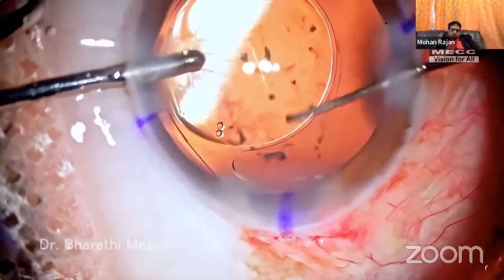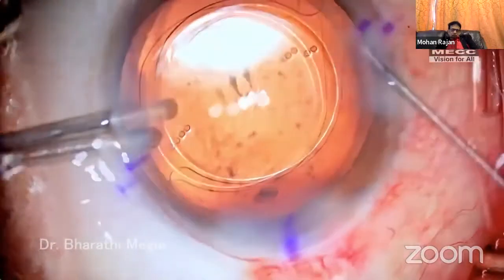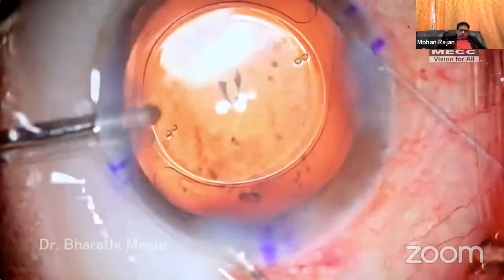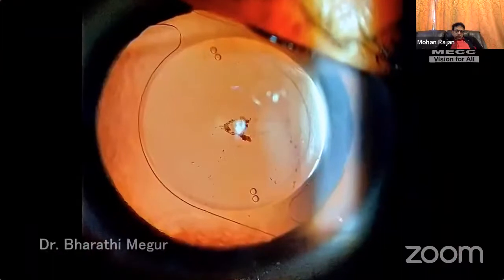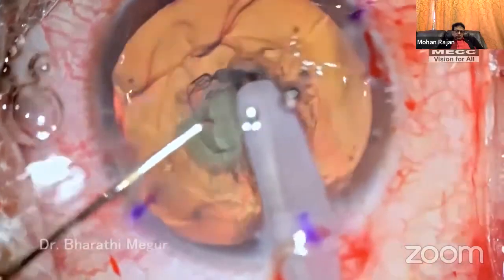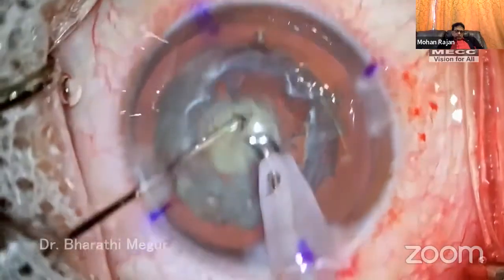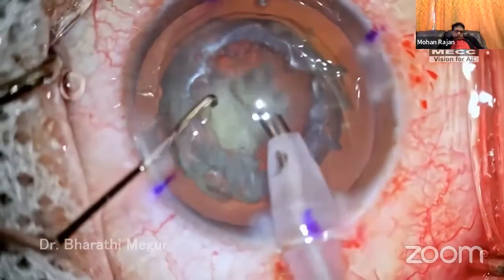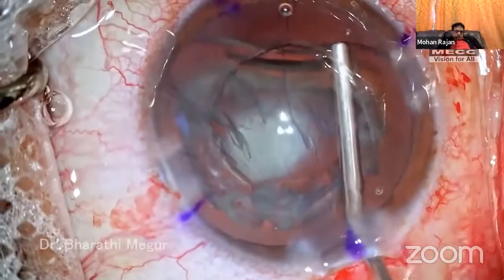Most of the OVD is removed slowly and carefully, with the possibility of a little OVD left behind the lens. The IOL is dialed to the predetermined markings using the dialer and irrigation. Side port hydration is done. These are the post-op pictures. The patient is doing fine; the lens is well centered and alignment is good. To summarize, this case demonstrates that by following the right strategies, one can minimize the chances of posterior capsular tear or anterior hyaloid rupture in eyes with posterior polar cataract.